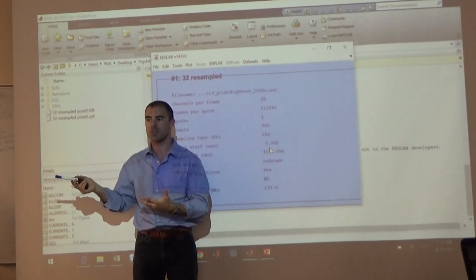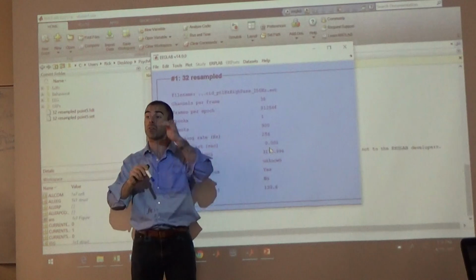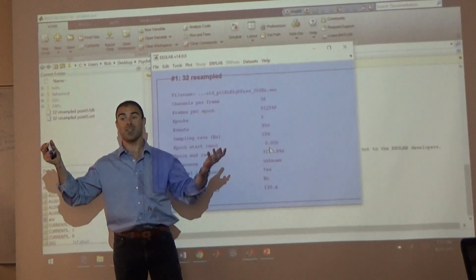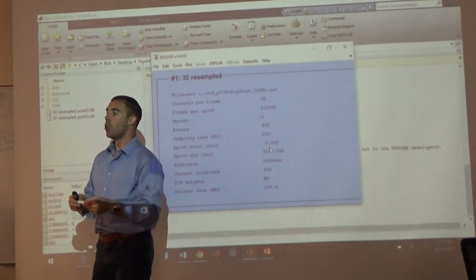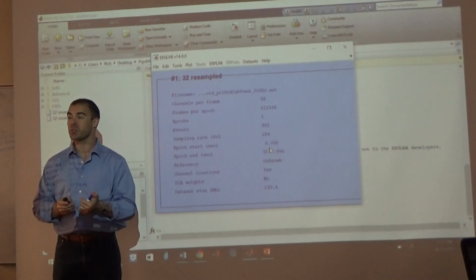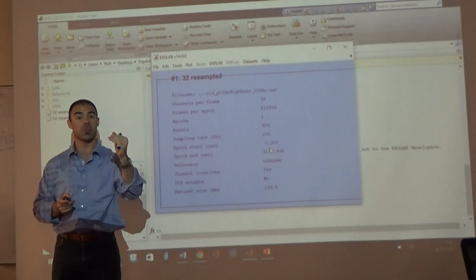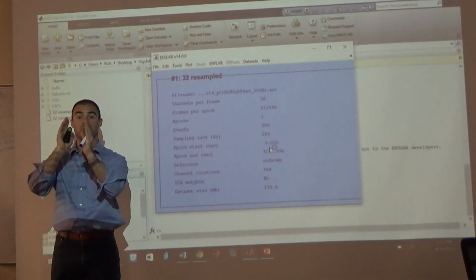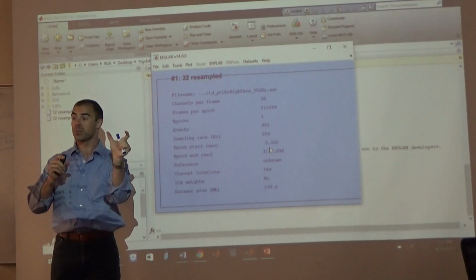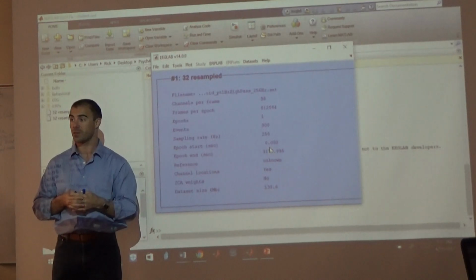What did the message say? We got to give it a list of all of our events. Now, ERPLab calls that an events list, right? So, what this means is that, remember all of our combinations? Remember there are 75 combinations of events that we said? You have 61, 62, 63, followed by the item judgment and the source judgment. That made a 4-digit number that there were 75 possible combinations of. Everybody remember we talked about that?